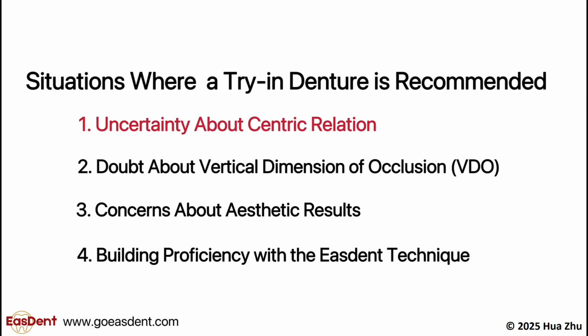First, if you are unsure whether the centric relation is correct, especially in cases where the patient is difficult to guide into the proper position or the ridge is severely resorbed, making it hard to stabilize the instant impression in the mouth, a try-in visit can help verify the centric relation.